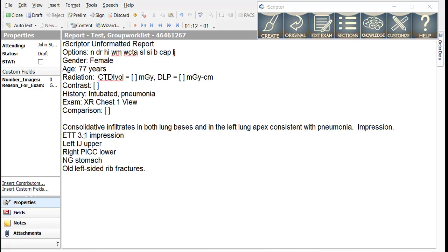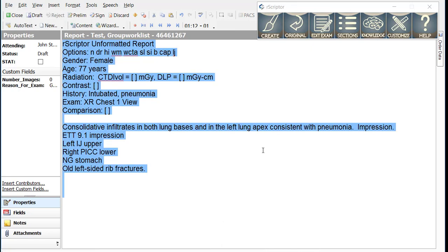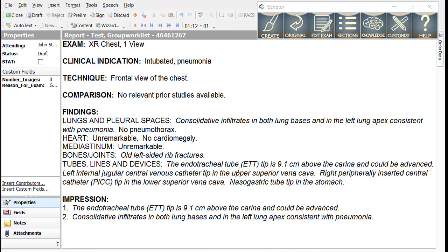If the ETT was too high in location, the number was large, say 9.1 centimeters, and we created this report, we would actually get different text in the impression section that said that the ETT could be advanced.